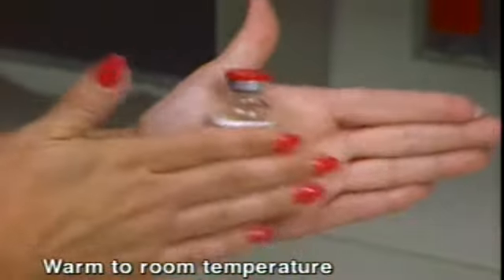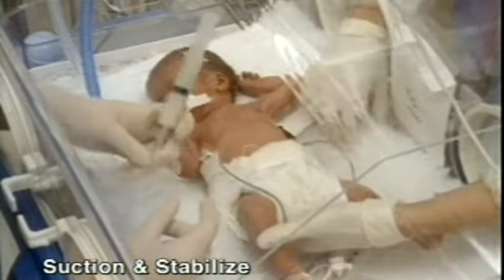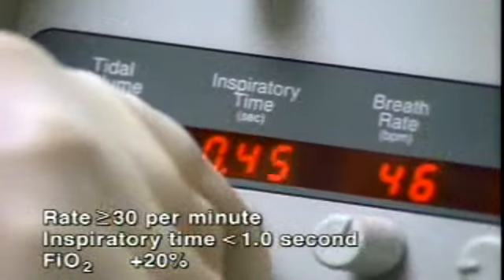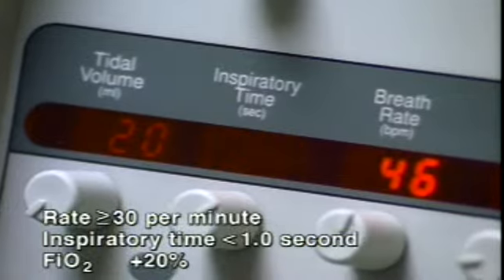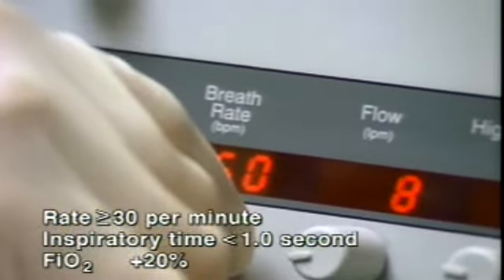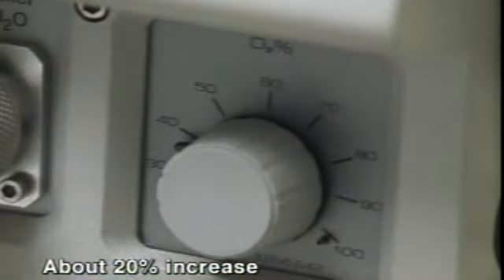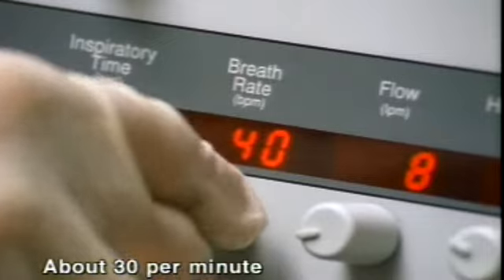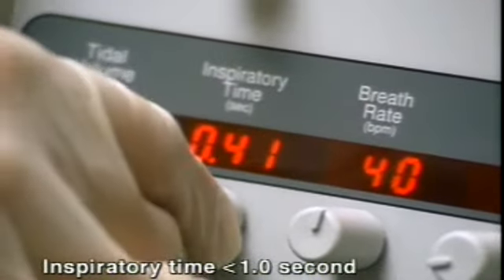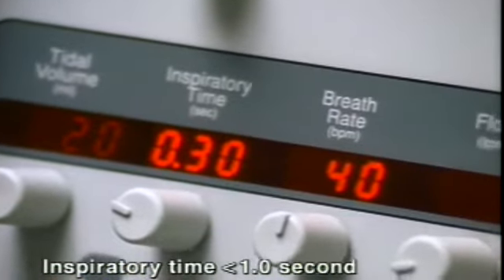As always, be sure to warm the drug to room temperature for each treatment. And make sure the infant is suctioned and stable. Adjust the ventilator settings each time. In clinical studies, ventilator settings were different for repeat doses than for the initial dose. Increase the concentration of inspired oxygen by about 20%, or an amount sufficient to prevent cyanosis. Set a rate of at least 30 per minute with an inspiratory time of less than 1 second. You can always adjust these settings to ensure adequate oxygenation and ventilation.